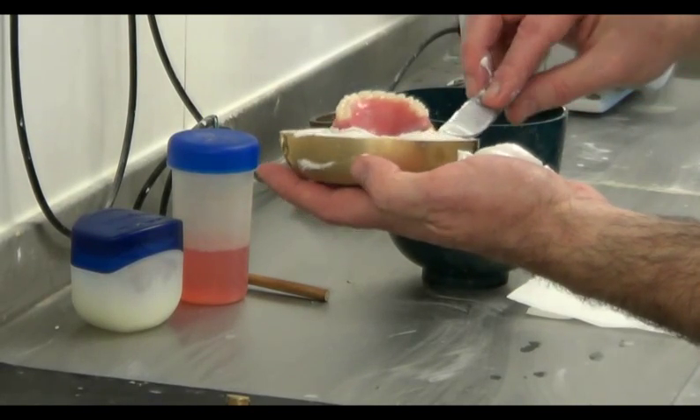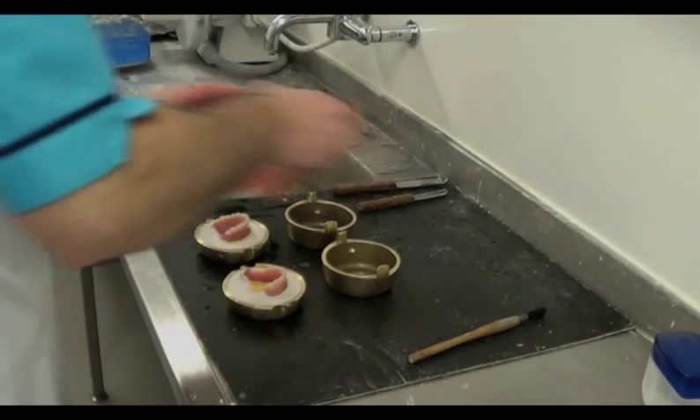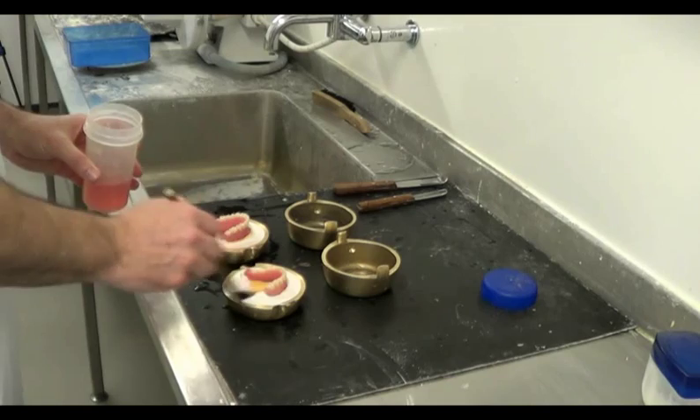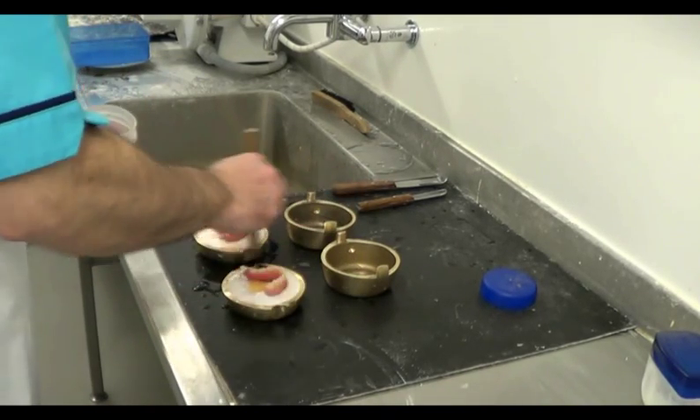The plaster in the lower halves of the flasks is left to set. Prior to topping the flasks, we must remove the metal discs from their thicker sections. We use a separating agent — in this case sodium alginate — which is painted onto the plaster surfaces.